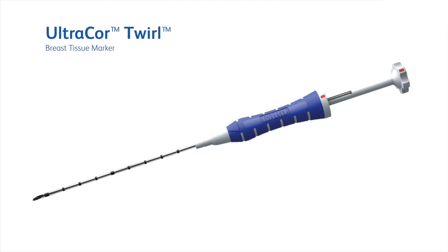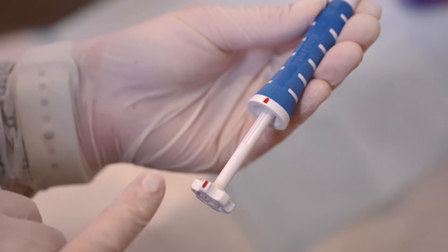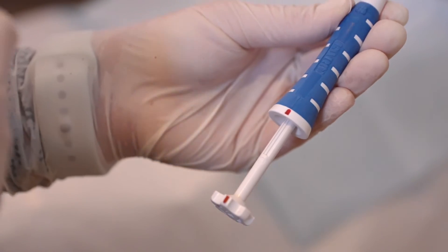We are now ready to place the twirl marker. It is a 17 gauge and is 10 cm in length. It is important to ensure both red markings are aligned, as it will not deploy should this not be the case.